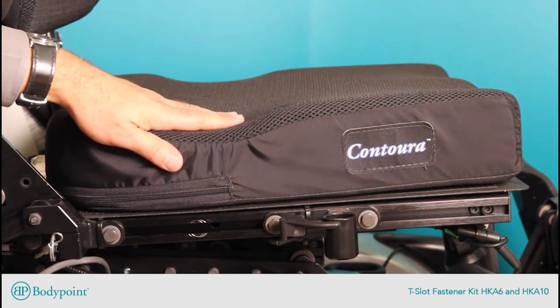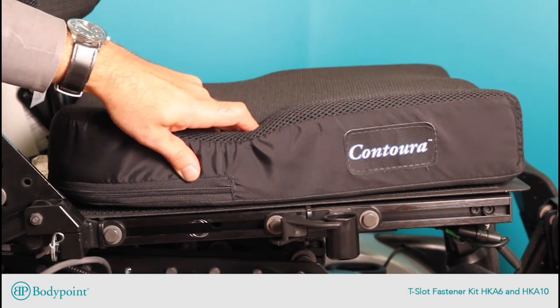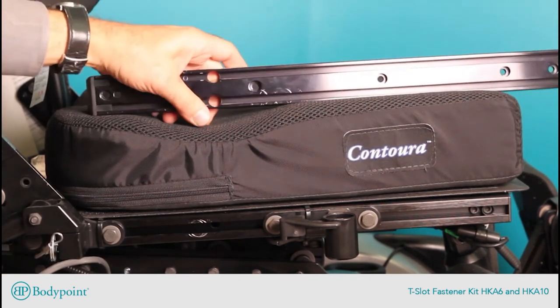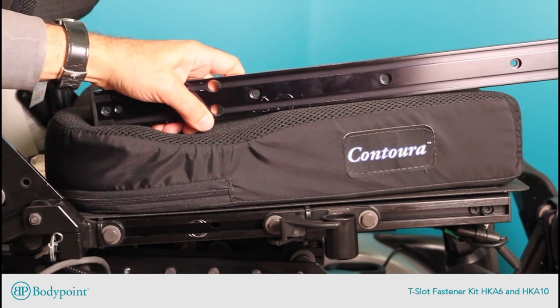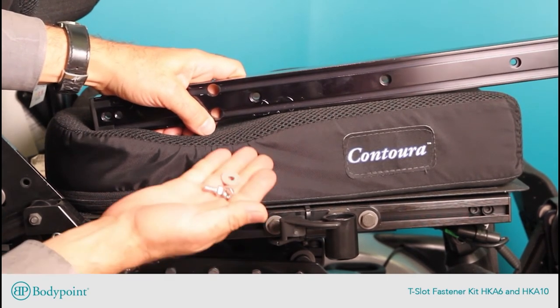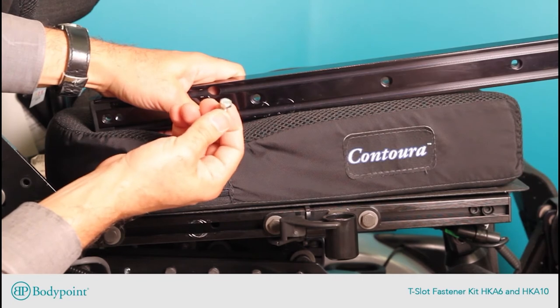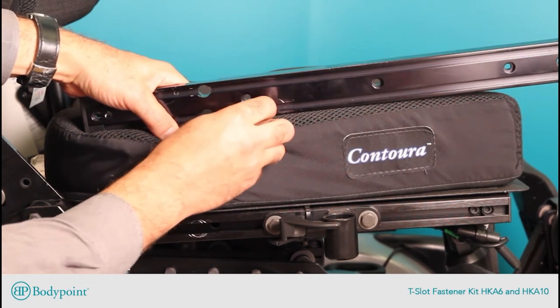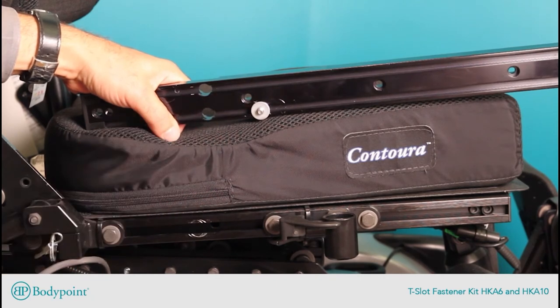This is an Invacare power chair which has the new Modulite T-slot system — a 10-millimeter T-slot. The same dimension of T-slot can be found on Pride Quantum power chairs. Permobil, however, has a 6-millimeter T-slot, and so we have another fastener kit called the HKA-6. The HKA-6 is very similar to the HKA-10, except it replaces the quarter-turn nut and stud with a simple 6-millimeter hex head cap screw. For installation, you simply insert the head of the screw into the hole, slide it into position, and then add the washer, the end fitting, and the nut, as I previously demonstrated.